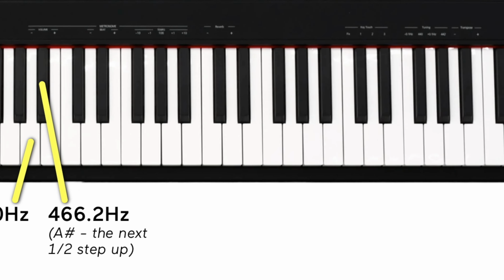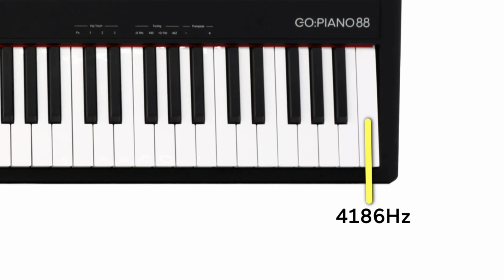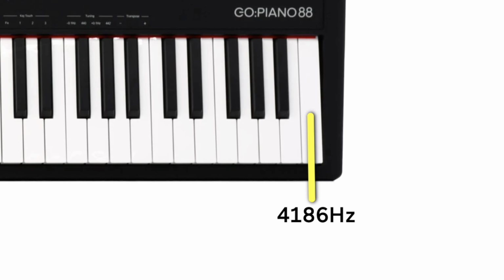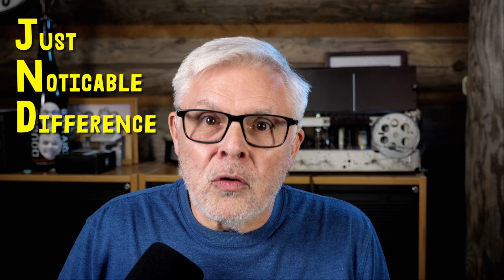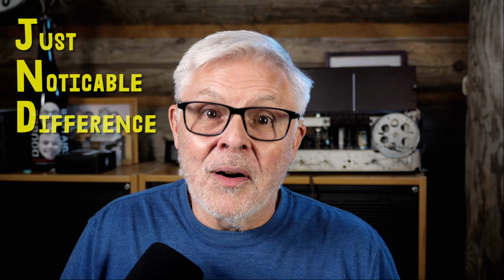Now, let's jump to the highest note on a standard 88-key keyboard. That's 4,186 Hertz. Actually, it's 4,186.009 Hertz, but who cares? By the time you get up there, the JND, just noticeable difference, jumps up to several percent, and it just gets worse from there. Isn't that cool? Okay, well, I thought it was cool, and here's why.